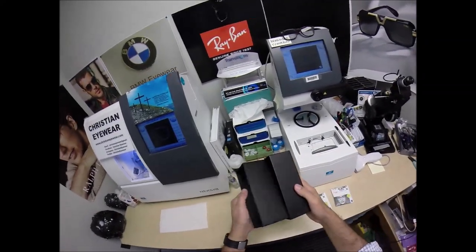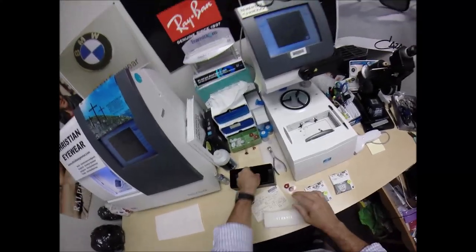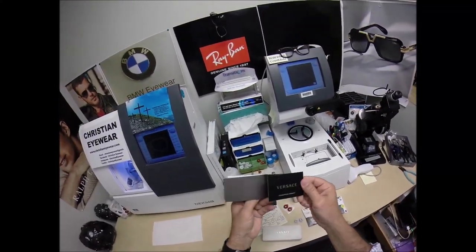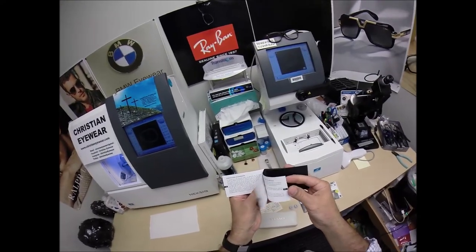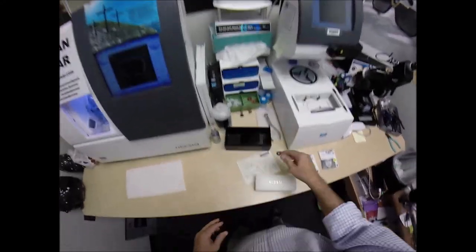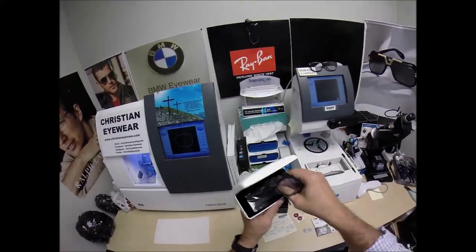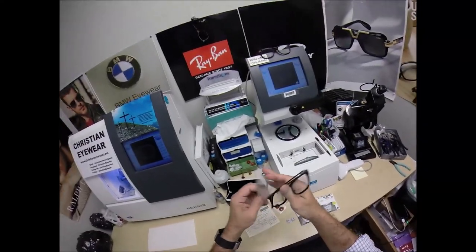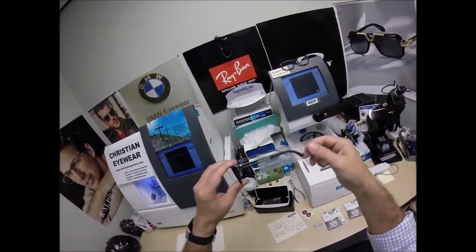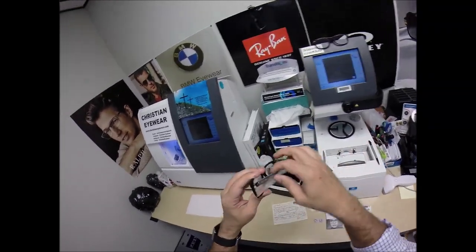Let me take everything out of the original packaging as Versace sends it to me. Of course, you've got your card of authenticity, your international warranty, and multiple languages — which I have no idea what they say, but it's in there. And of course, your Italian leather Versace case, your Versace cleaning cloth, and the star of the show, the main attraction. It comes with a little plastic sleeve on the left temple to protect the temples from rubbing together during shipping.